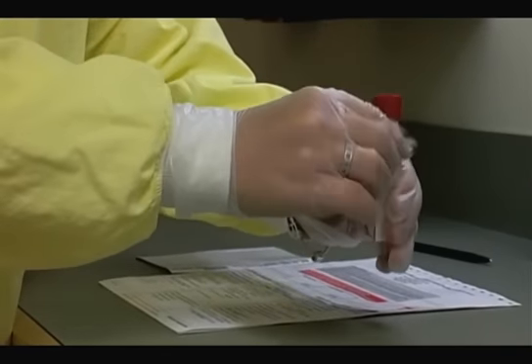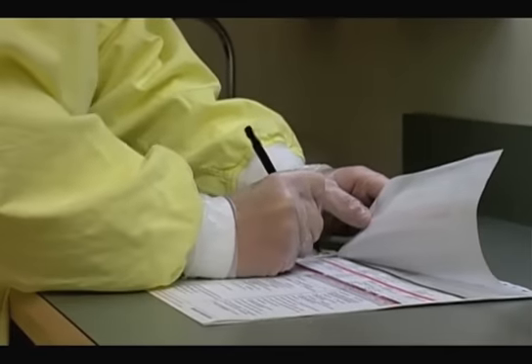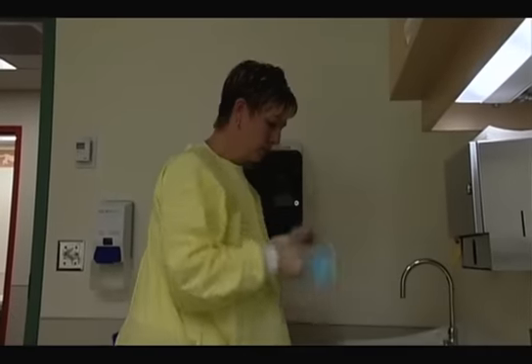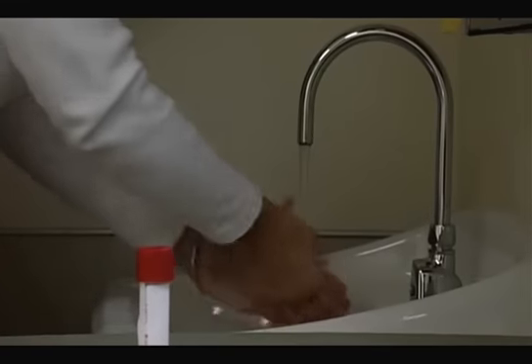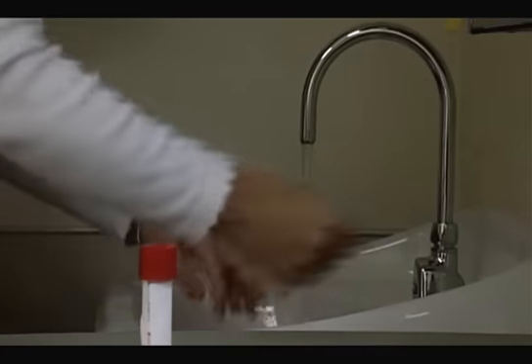Complete the labeling of the sample and requisition prior to sending it to the laboratory for testing. Remove your protective equipment and perform hand hygiene.